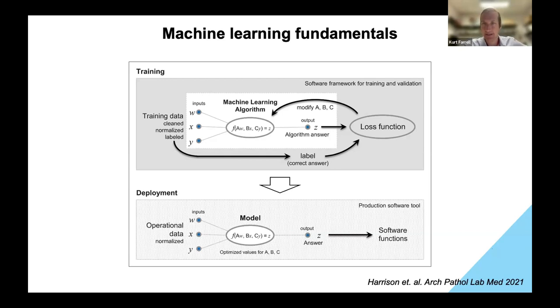So basically, during the learning, the output of the algorithm is progressively modified based on the input data. The learning process, referred to as training, doesn't modify the programming code of the algorithm at all in most forms of machine learning. Instead, the algorithm contains parameters, sometimes called weights and bias values, that are modified during the training to change its output. The algorithm, together with its modified parameters, is termed the model, and the training process is sometimes called building or training the model. So that's what you saw Dr. Koga discuss previously. A typical model development contains the algorithm embedded in the management software and trains the model by feeding the instance data to it, evaluating the accuracy of its output, and modifying the parameters to improve the accuracy.